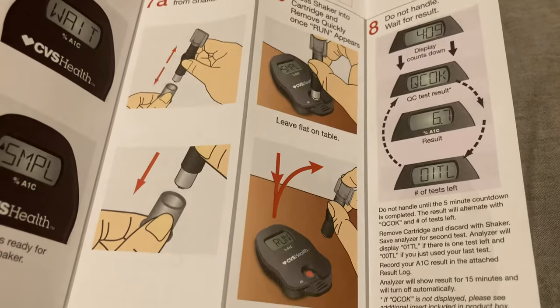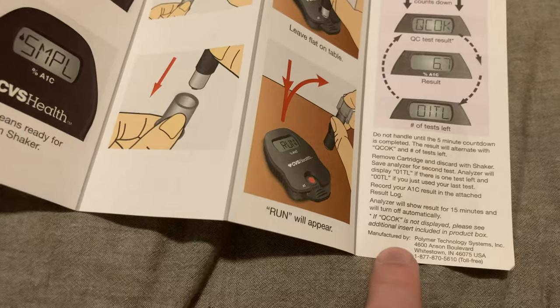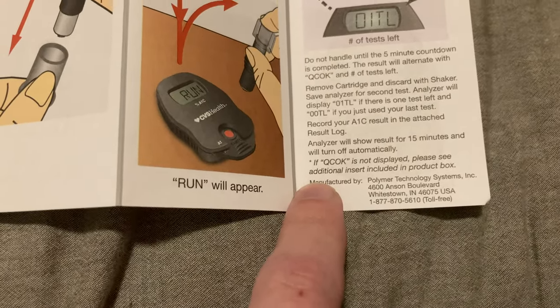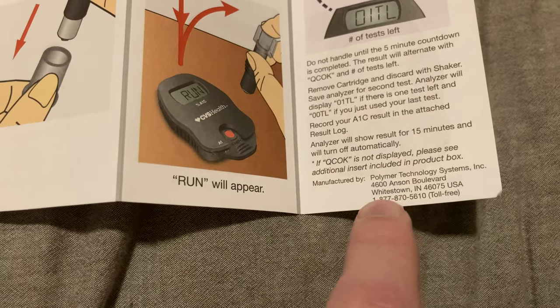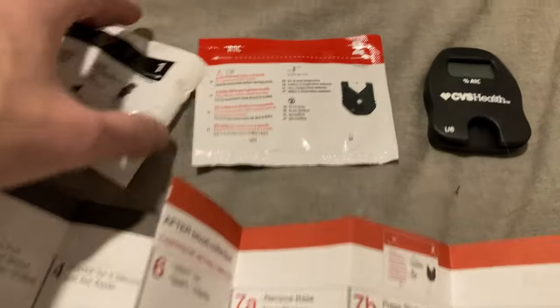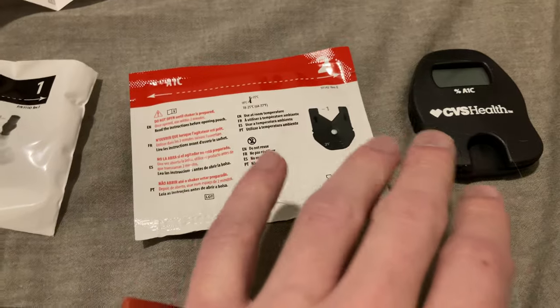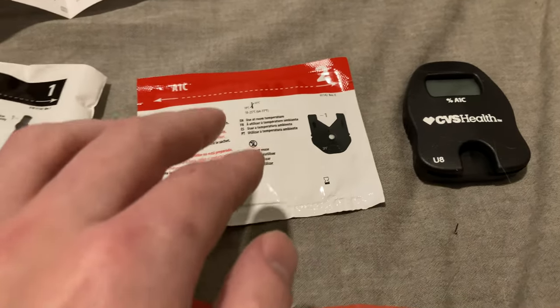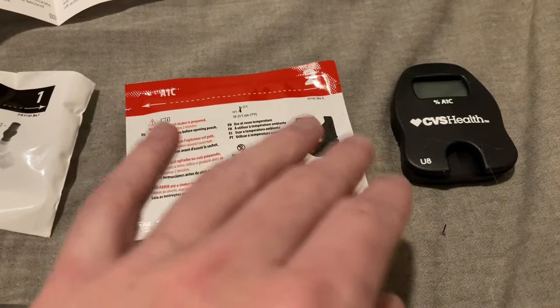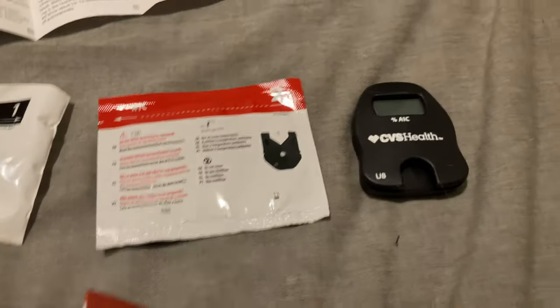That's the whole reason the A1C test makes sense. And we see here that it was manufactured by this group. And there's their phone number if you want to call them to inquire. The reason this is a polymer technology is the type of test has to do with using polymer beads. Some kind of electrical conversion. So the polymer bead here produces some kind of change that the unit converts to a value using a formula.